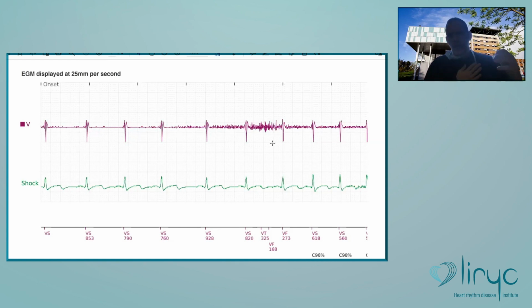And then I will do many things for pectoral myopotentials. So some maneuvers, specific maneuvers to try to replicate this. And the second thing, I will ask the patient to breathe lying or standing in different positions, and deep breathing, Valsalva. And then most of the time, if this is a problem of myopotential sensing, you will have the possibility to replicate and see which kind of oversensing.